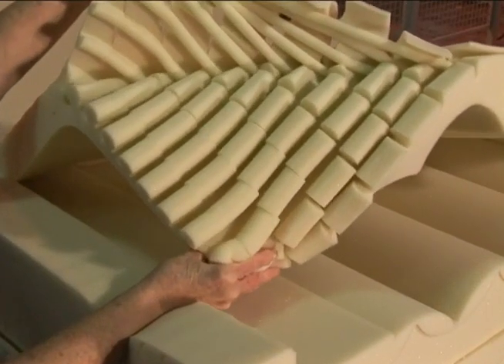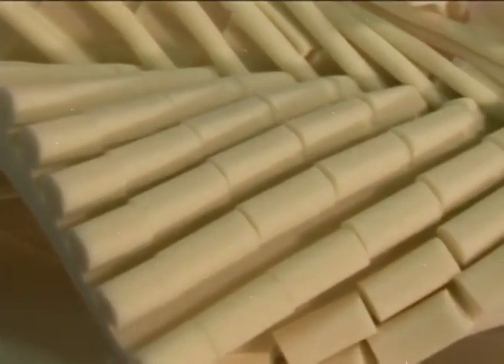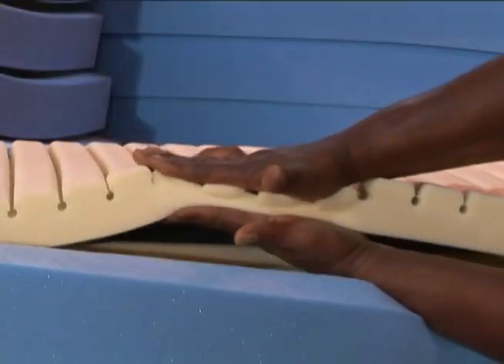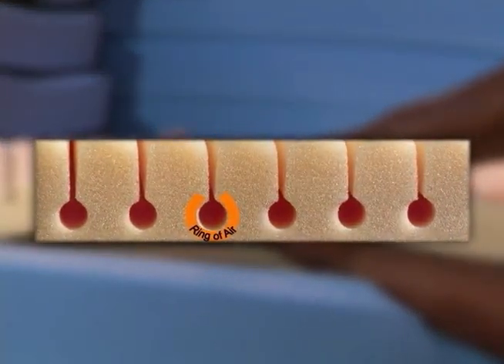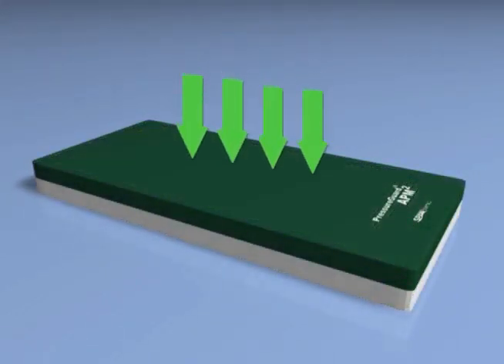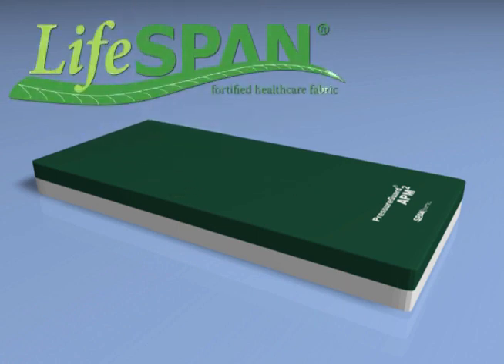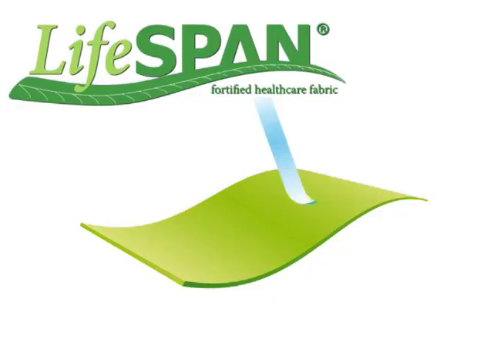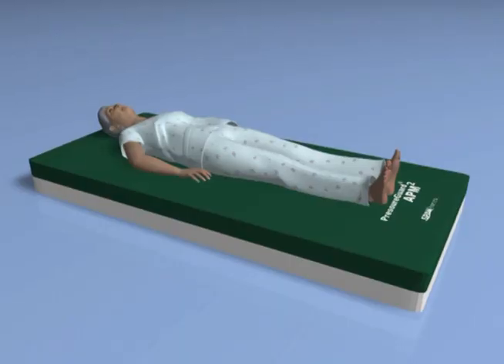Span America's solution to shear force trauma begins with the shear reducing geomat top layer, with over 800 individual pressure redistributing support cells and the ventilating action of the exclusive ring of air design, which reduces heat and moisture buildup on the skin. Above the surface of the mattress itself is the unique design of the antimicrobial bi-directional stretch cover made with Span's superior Lifespan fabric.